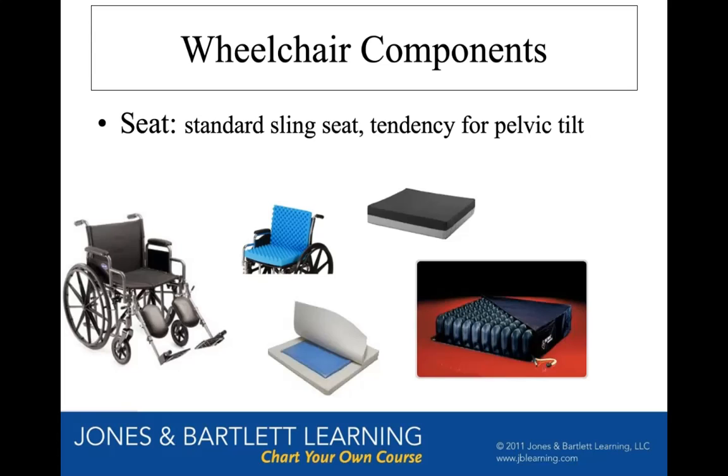There are newer cushions that are coming out every year. Companies are making them new every year, just like any other model of car. There's cushions now that are like half gel, half air, that are combinations, and those tend to be a good compromise for some people. But there's just all different brands out there. You don't need to remember any of the brand names. Just know that there's foam, gel, and air cushions.